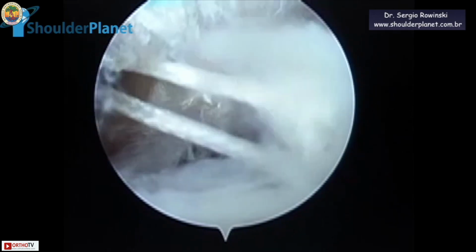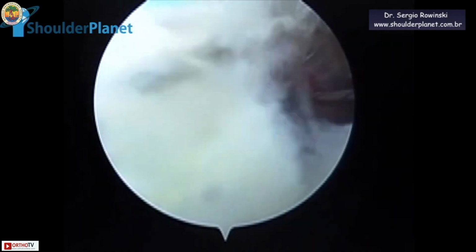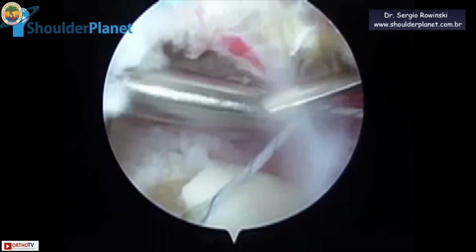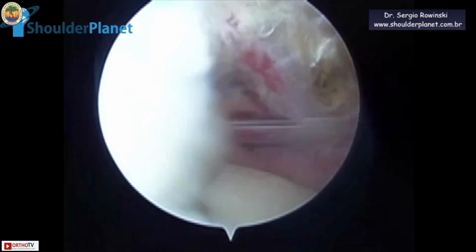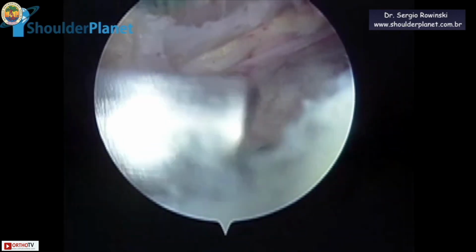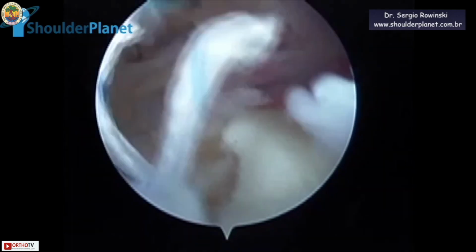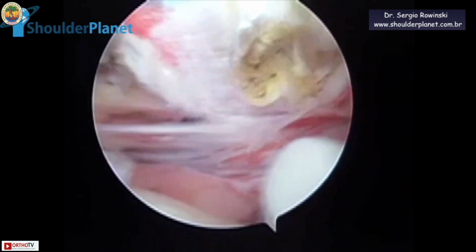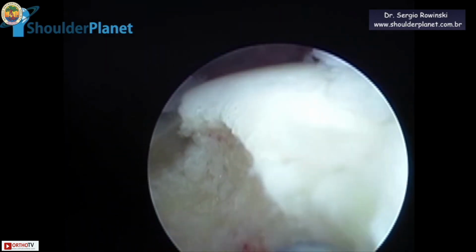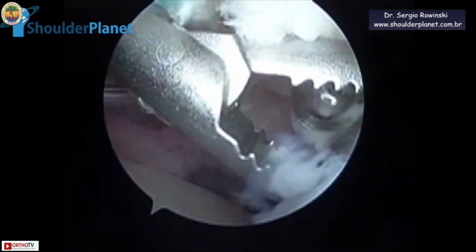Then we quickly moved the camera to the posterior portal and tied the first knot from the anterosuperolateral portal, and we then moved the camera back to the lateral portal, removed the sutures from the anterosuperolateral portal, and then we tied the second knot. After the knot was done, we would have to reassess the tendon coverage, and still there was a reasonable part of the head to be covered, even with a medialized footprint.